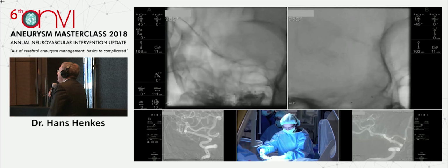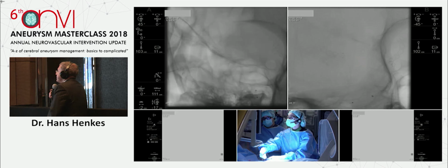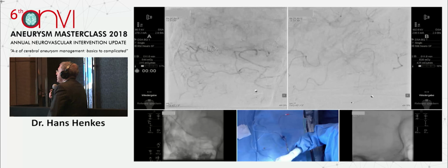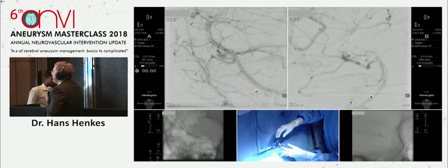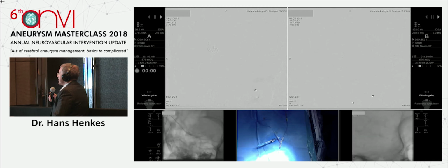So, final run in apnea. So, no damage so far, right? That looks good. Okay, good, perfect, excellent.